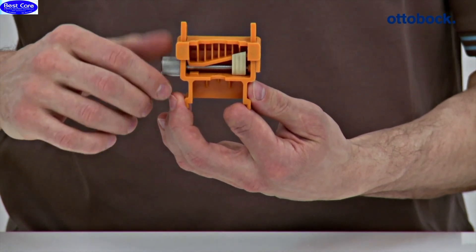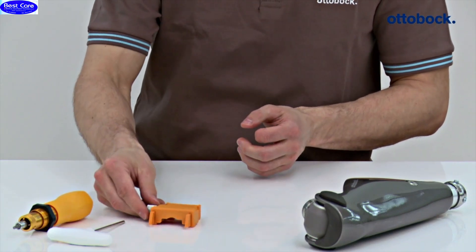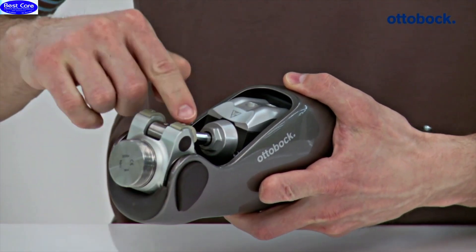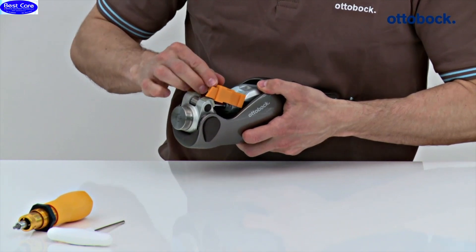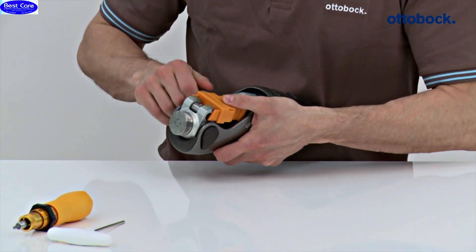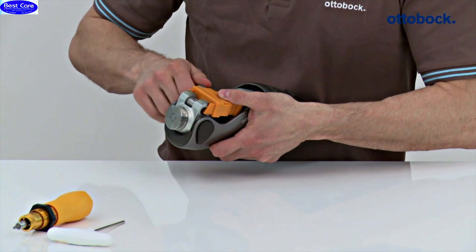Turn the adjustment screw of the knee extender counterclockwise, setting the knee extender to the minimum height. Extend the knee joint. Check whether both flexion stops are mounted on the knee joint. Set the knee extender onto the hydraulics housing and slide it into the stop. Turn the adjustment screw clockwise until you can feel a resistance and the knee extender touches the flexion stops.